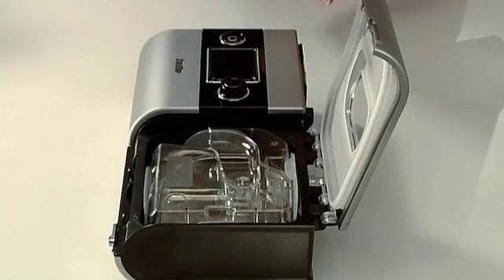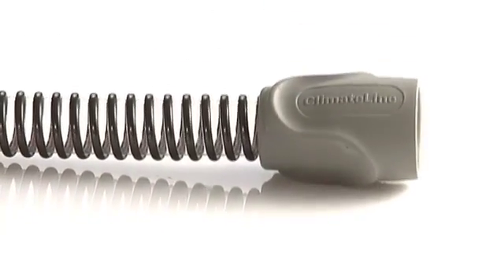In terms of bricks and mortar it consists of two things. One's a humidifier, which is a box with water in it. And the other one is a tube — but it's a different tube. It's a powered tube, a heated tube, which we call climate line.